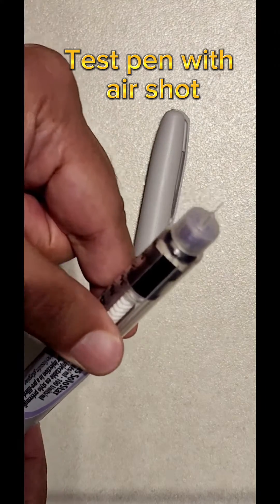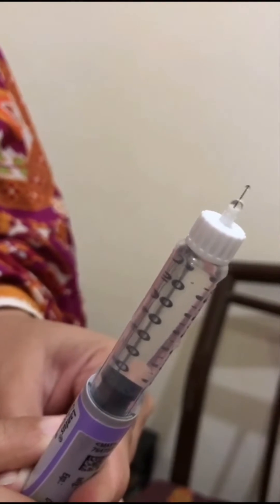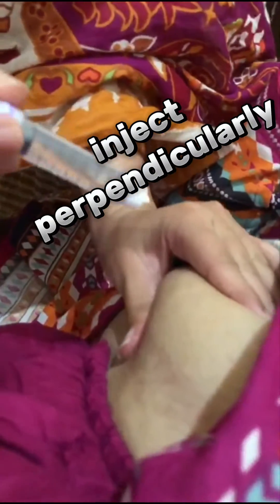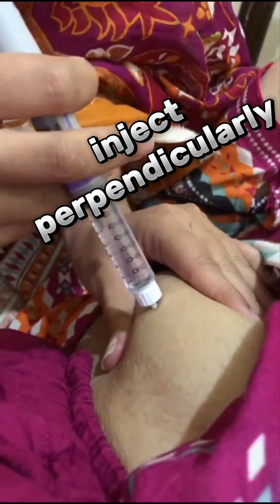Make sure you do a test dose, which is an air shot, to see whether an insulin drop comes out. If the insulin drop is coming, the pen device is working fine and the next step is to dial the correct dose. Ensure the dose is correctly dialed and go perpendicularly at the site of insulin injection.